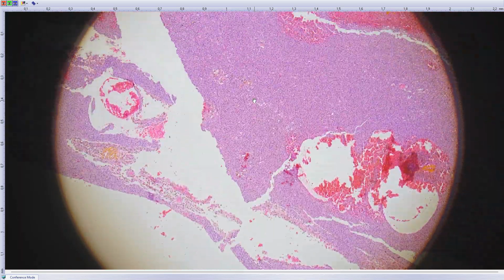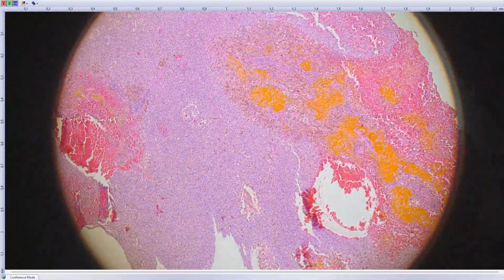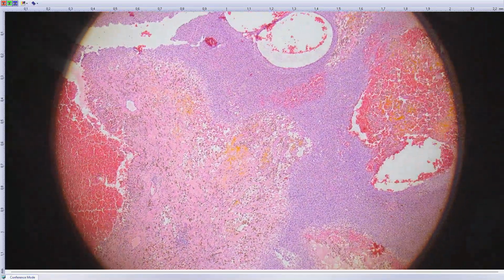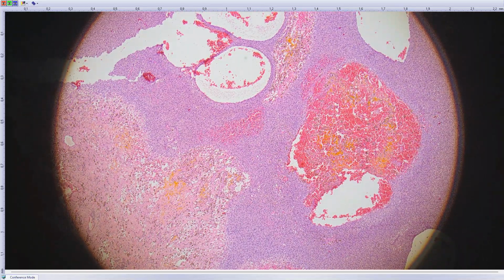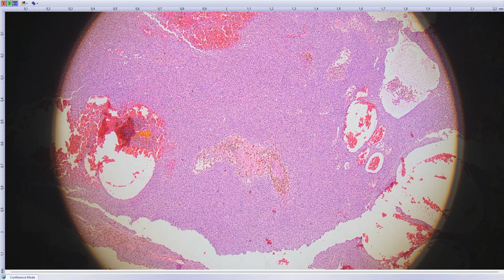And this is the last example of the same thing. This is a tumor of the testis, which is rather similar to solid pseudopapillary neoplasms of the pancreas than to the signet ring cell stromal tumor, but this is rather because this tumor is larger, so it also has degenerative changes like pseudopapillae, which are the result of degeneration after hemorrhage.